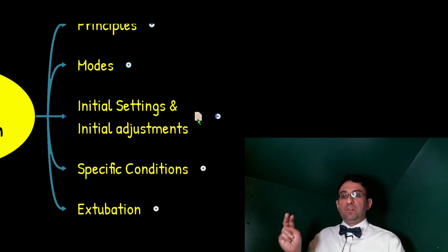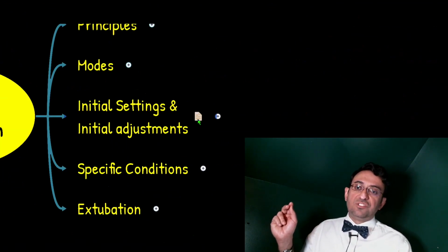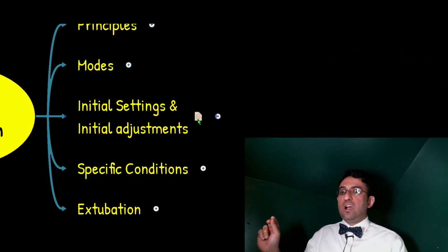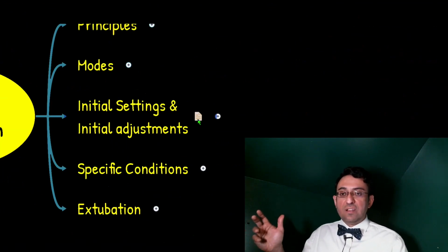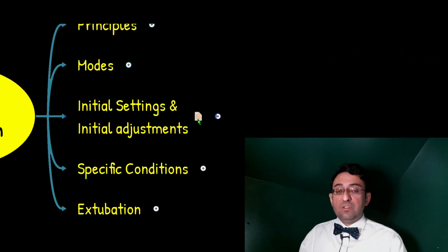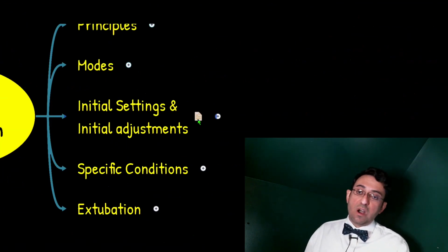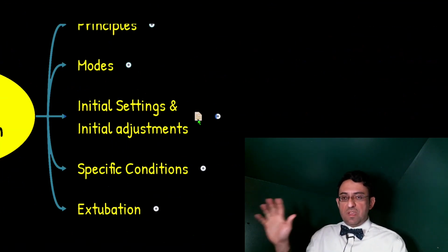The second principle is keep the tidal volume at the value of 6 to 8 milliliter per kg, except in the cases of ARDS and interstitial lung disease and fibrosis, or generally decreased compliance conditions, as we discussed, where reducing work of breathing requires low tidal volume ventilation, and in those conditions we keep the tidal volume of 4 to 6 milliliter per kg. If you just remember this, you will be safe.